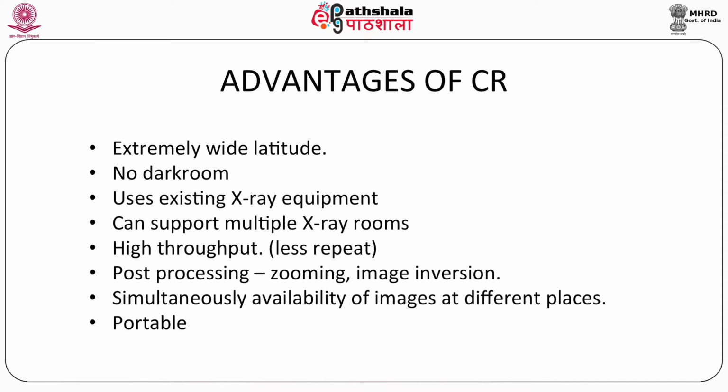Now, the advantages of CR plate. It has an extremely wide latitude, and there is no need of any dark room. It uses existing X-ray equipment, conventional X-ray units, and can support multiple X-ray rooms. So, high throughput and very few repeat exposures. Post processing, zooming, image inversion is possible. It is time saving, with simultaneous availability of the image at different places.